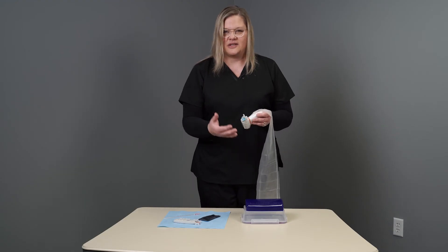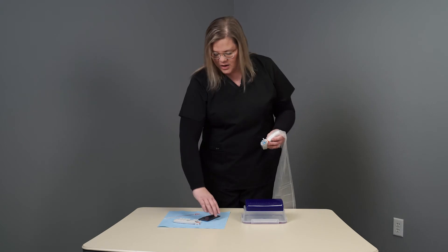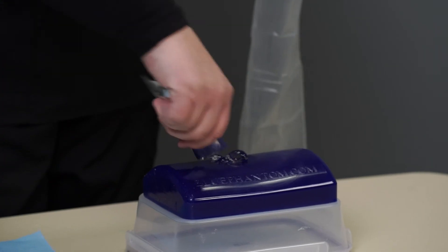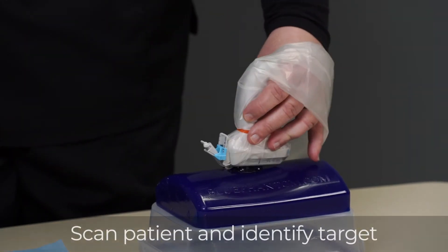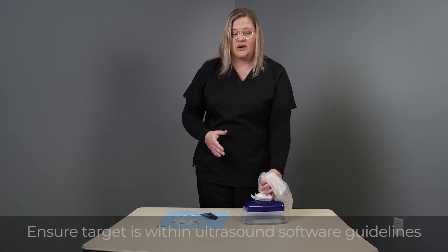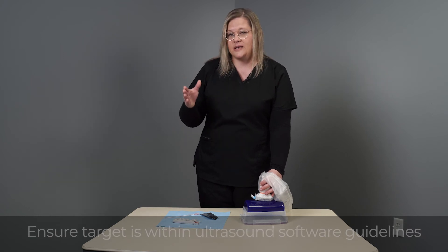Now that your guidance system is fully assembled, we can move on to scanning the patient to select the angle of biopsy. You will apply your sterile gel to your patient, then scan the patient to identify your target.